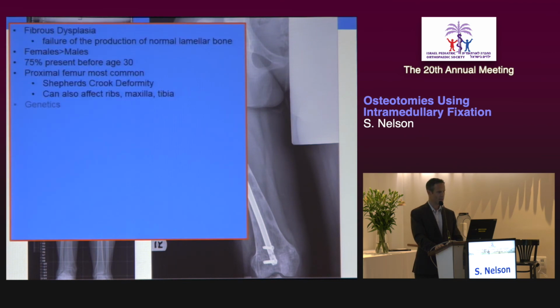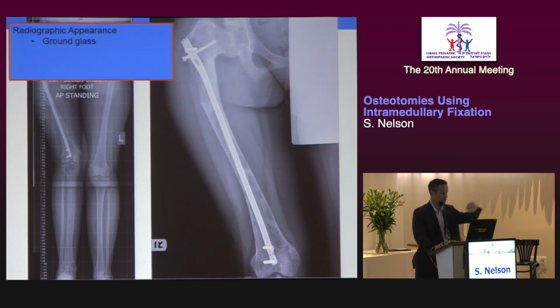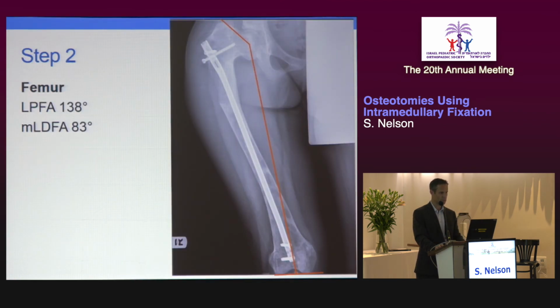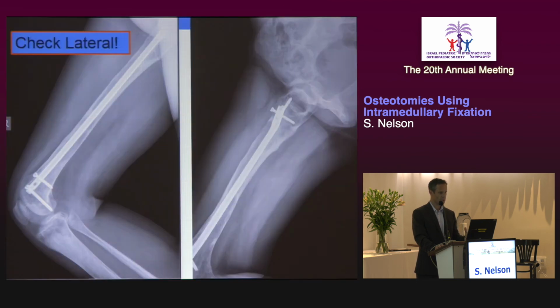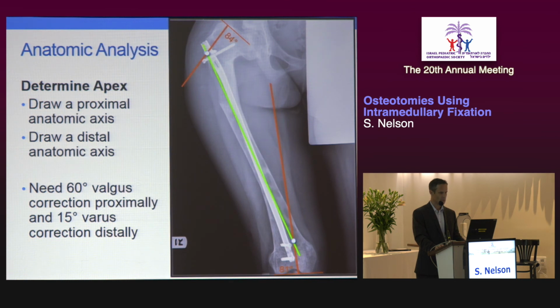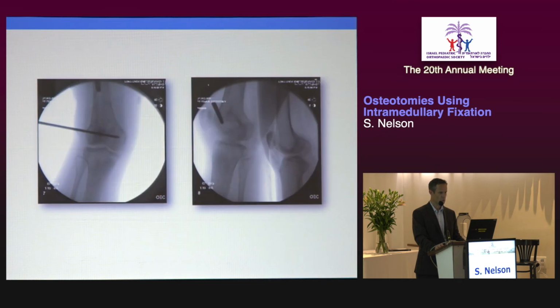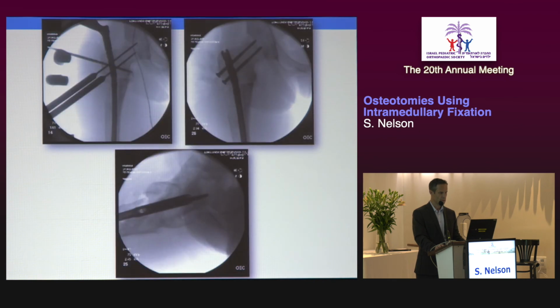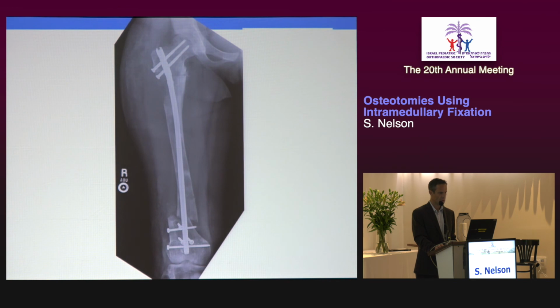Okay. Final case of using intramedullary nailing for a multi-apical deformity in a case of fibrous dysplasia here, with both a proximal deformity and a distal deformity in the femur. 2 apices, and chose to cut the bone in 2 different locations, placing intramedullary nail, rotating around that apex, creating translation at the osteotomy site, and final alignment.